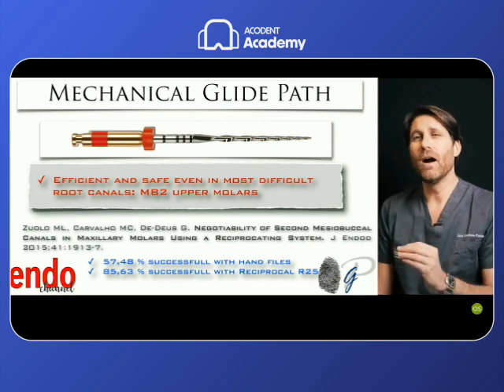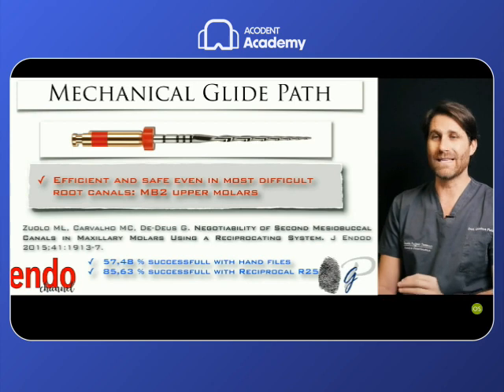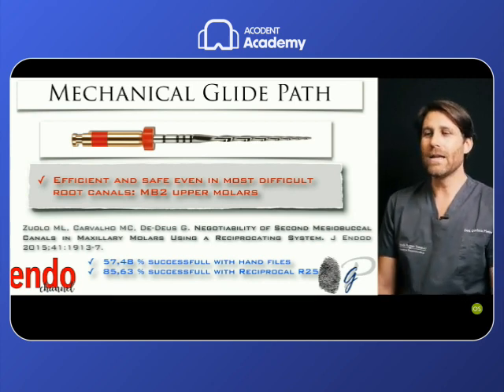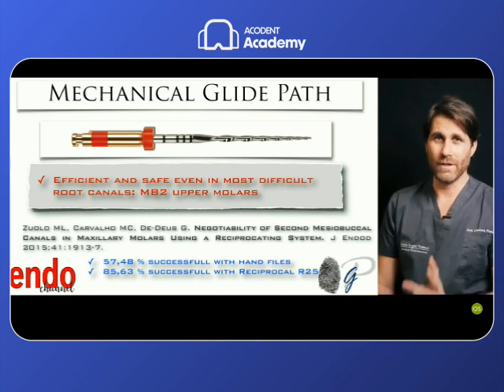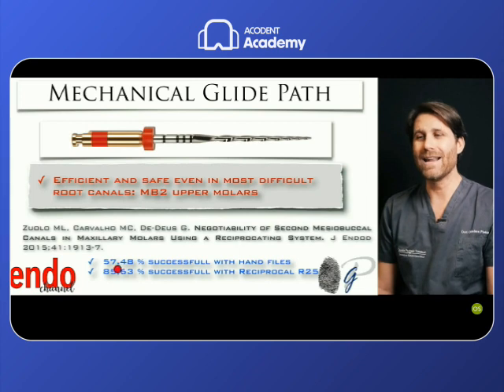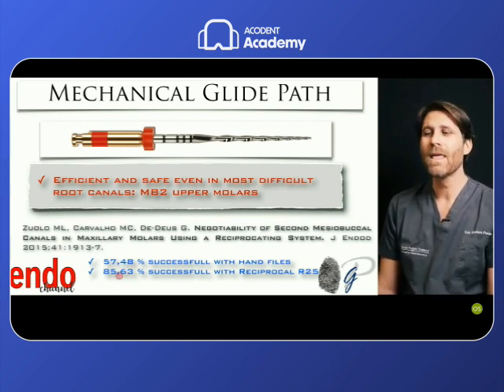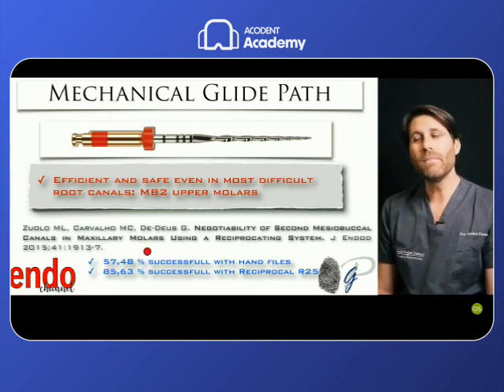These other articles made by great clinicians like Mario Zuolo, Maria Cristina Carvalho and Gustavo De Deus have been performed specifically on the MB2 root canal, so on the scouting of the most difficult root canal in the mouth. And this is really clear in demonstrating the efficacy of this technique for the scouting of this root canal. More than 85% of the MB2 root canals have been scouted like this, while only 57% of MB2 root canals were successfully scouted with hand files.